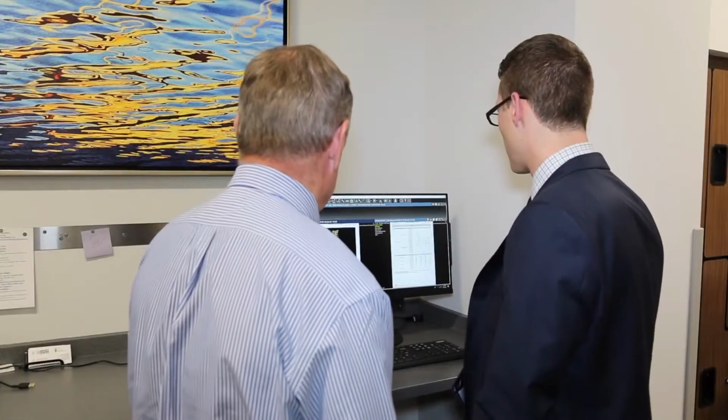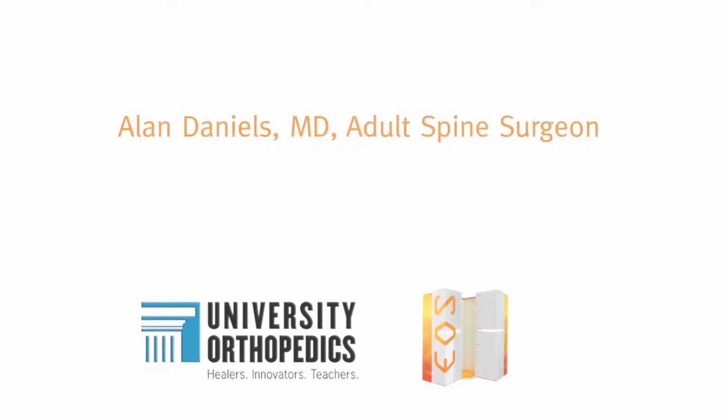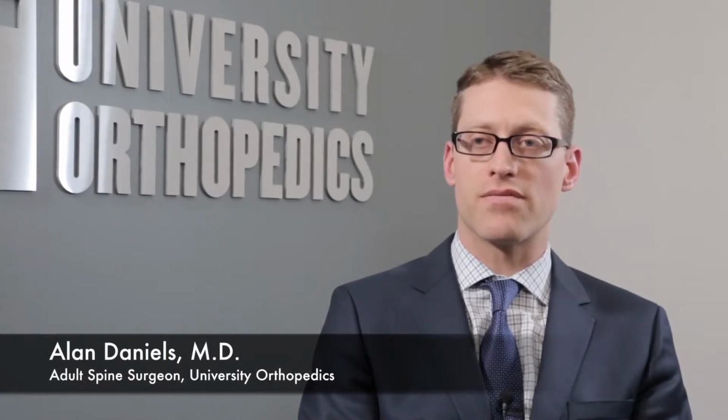The response has been phenomenal. The doctors love the images that they get from that machine. It is totally booked 100%. EOS is a very powerful tool in that it provides the best quality x-rays that we can get, and it's able to do so with the lowest possible radiation, so it's very safe for patients.